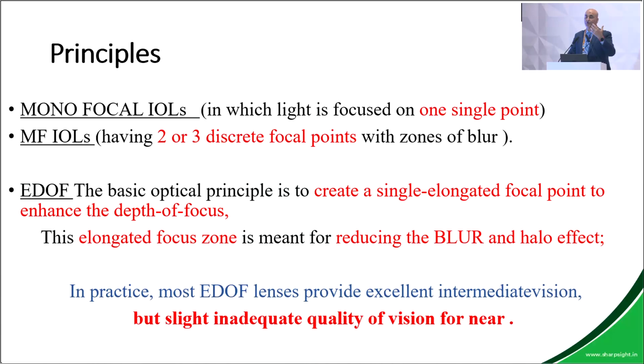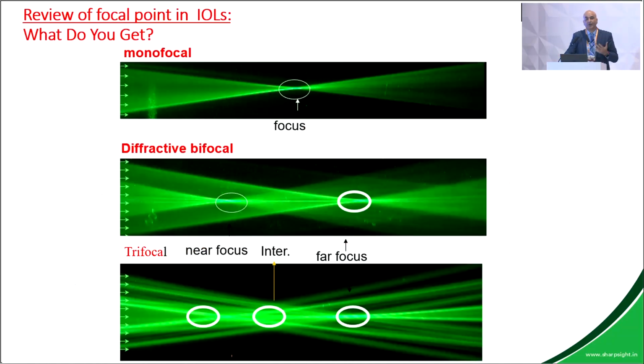So multifocals, we know, create a discrete point of focus, and there is a zone of defocus. So that is a big problem with multifocals, at least in my practice. I was doing 200, 250 plus multifocals a month, but the chair time was eating my head, because the amount of chair time I had to spend with the patient before, otherwise I was spending 10 times more after the surgery. So I was looking for an alternative which would probably give me a free hand and able to do more and more, the lens being more versatile.